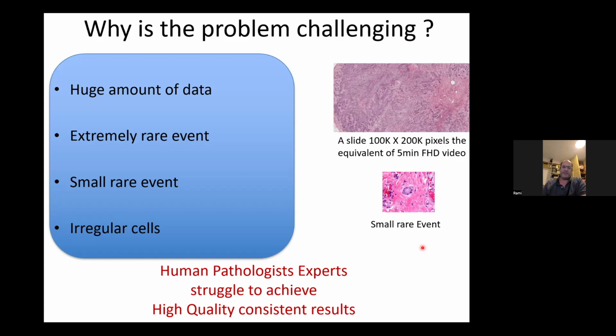And then the shape of these cells is very irregular because of the stage of development of the colons. So when human pathologists learn how to analyze this case, they are given few examples of how this looks, and then they need to deduce what they see in real cases. So we started with this idea in mind. No human being trained to diagnose Hirschsprung disease got more than that. No one gets more than 95 full slides, fully analyzed. All the data is available in order to figure out how to do this task.